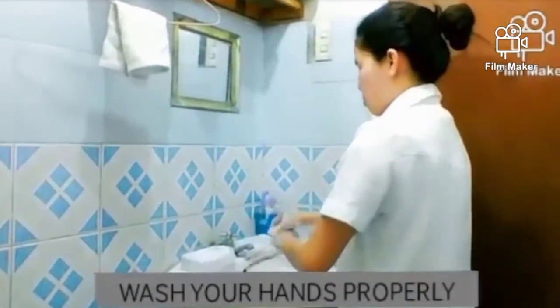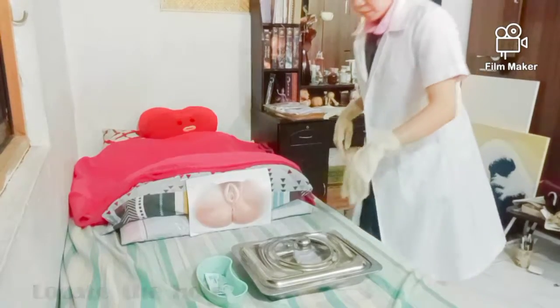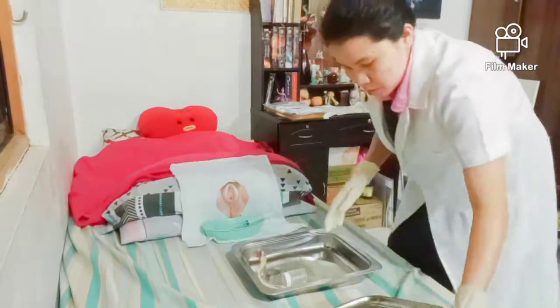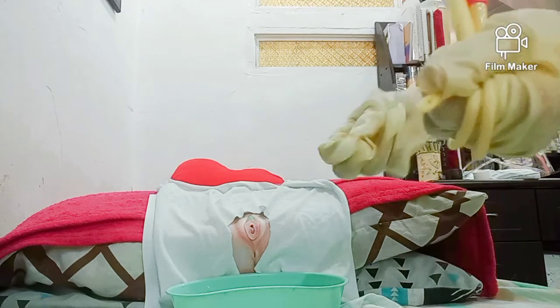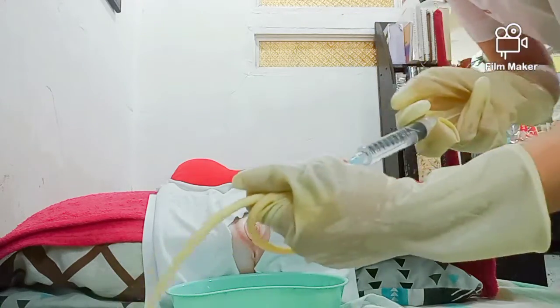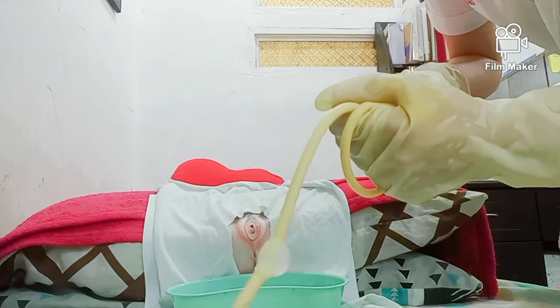Next is to perform handwashing. Always check if the area is clean and perform gloving. Check the natural vent of the catheter by twisting it around your hand and check the patency by inflating the balloon. Then withdraw, making sure that you withdraw the 10cc of sterile water.